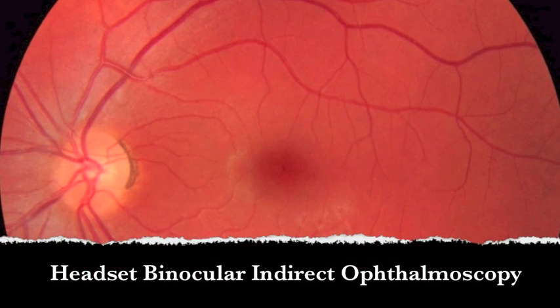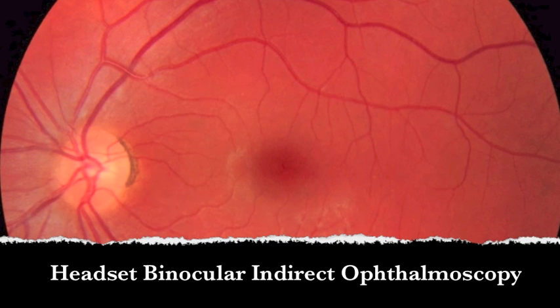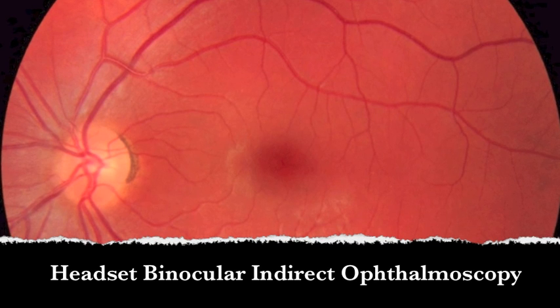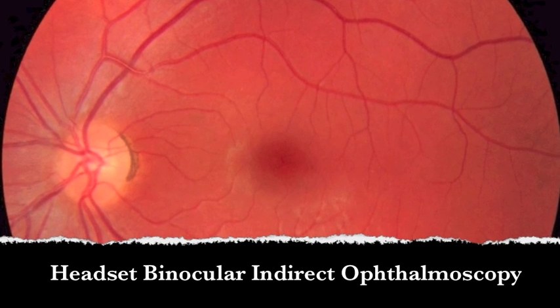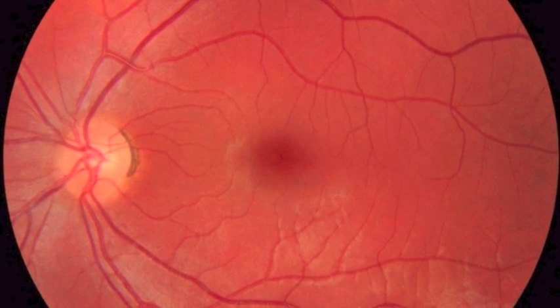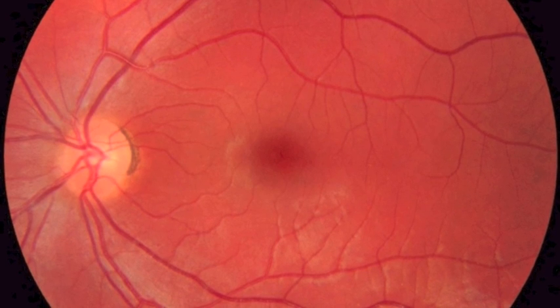Next we will have a look at headset binocular indirect ophthalmoscopy. For this procedure, a headset is worn by the practitioner and used in conjunction with a condensing lens to allow them to view the fundus. This allows a large area of the fundus to be viewed all in one go.